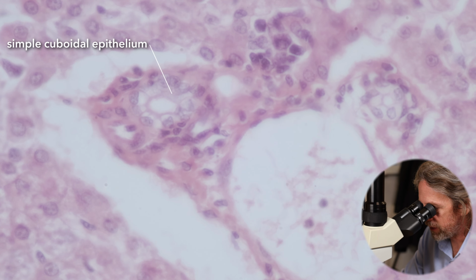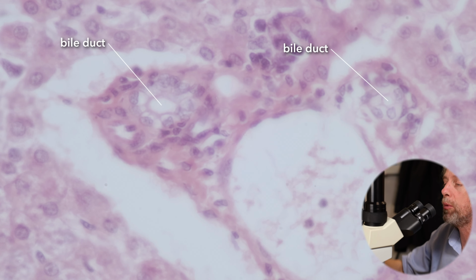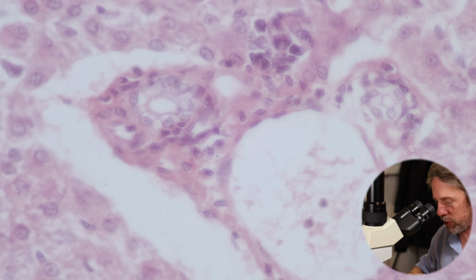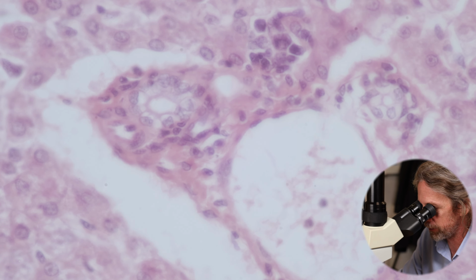So on the left there, that's a very, very small tube, and there are cuboidal cells, and to the top and the right there's another very small tube, with a simple cuboidal epithelium forming the epithelium that's lining that tube. Those are the bile ducts. Remember, we looked at the gastrointestinal tract, that tube that runs all the way through us, inside us, and it is lined by epithelium because it's an external surface inside us. So there's a barrier protecting the proper inside us from stuff passing through the gastrointestinal tract. So the glands and structures that have grown from that gastrointestinal tract and that duct into that gastrointestinal tract are also lined by an epithelium. So if we're seeing a tube here that's lined by an epithelium, this is a bile duct which is going to pass bile into the small intestine. These will drain to the hepatic ducts, then the common hepatic duct, and then the common bile duct, and then to the duodenum.